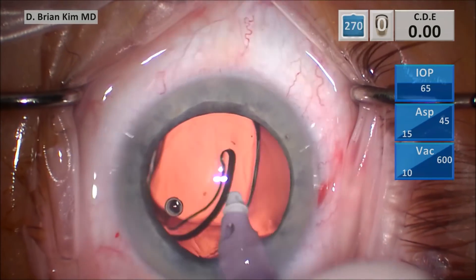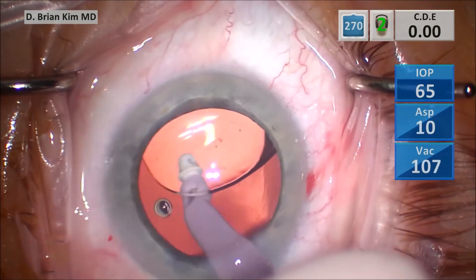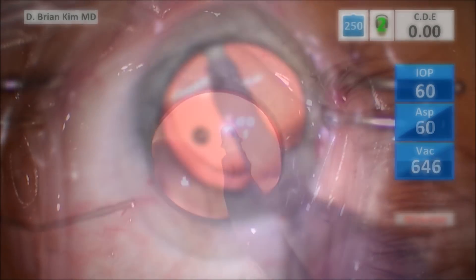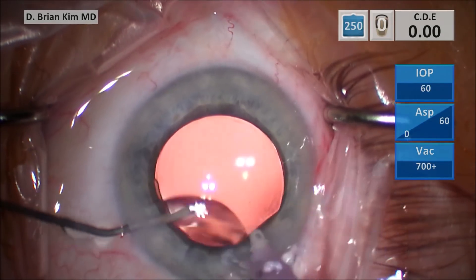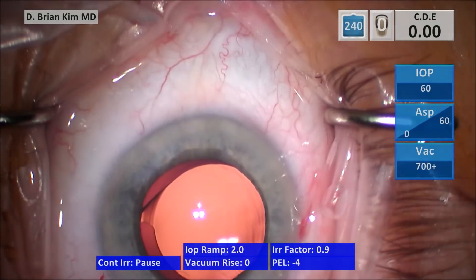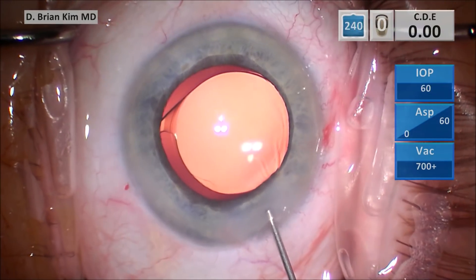You're getting under the optic, pushing on the left side, and that causes the lens to rotate 90 degrees very easily. You're removing all the viscoelastic from underneath the bag. You're not causing any zonular traction because you're actually tilting the optic as you do that. Because you're pushing the optic into the capsular fornix, you're ensuring that the haptics are also within the capsular bag.